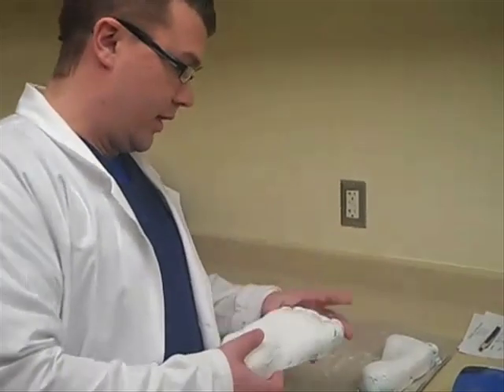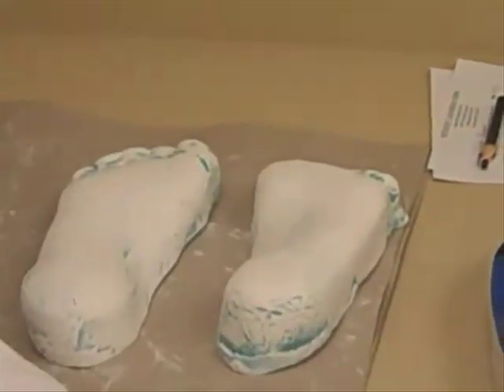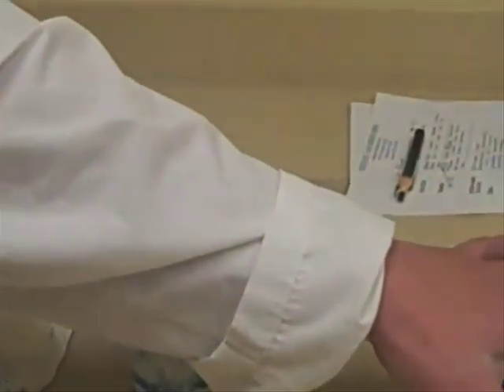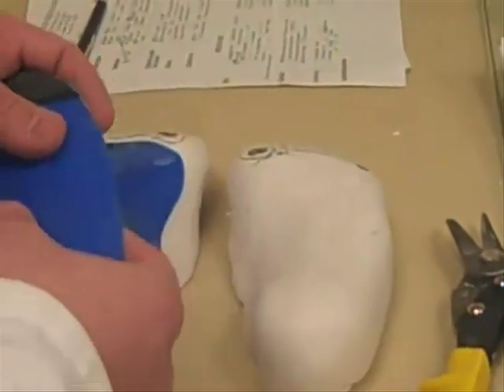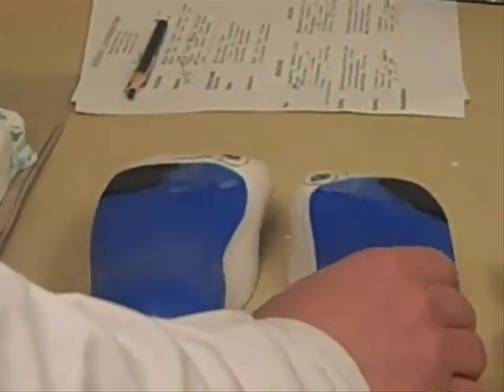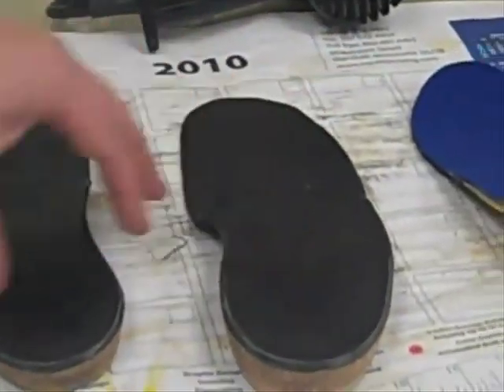We start out with a casting of the patient's foot, as you can see here. This is pressed with a semi-flexible, semi-rigid plastic and then posted per my prescription, and then you end up with various end products here.